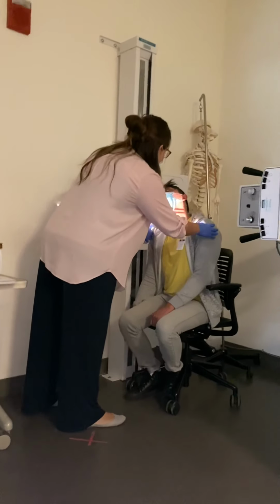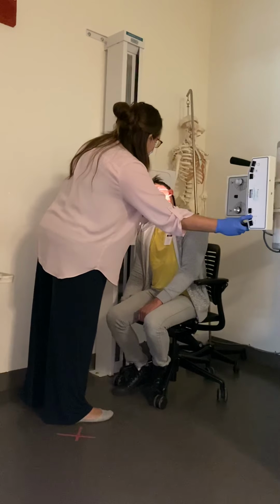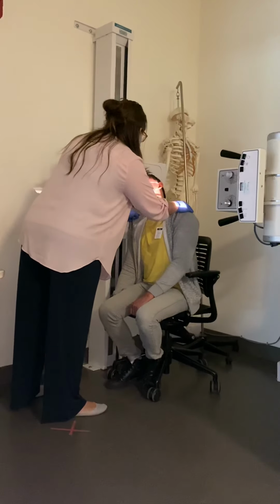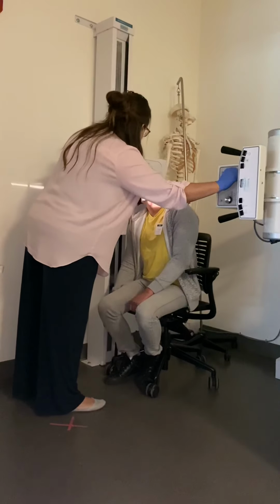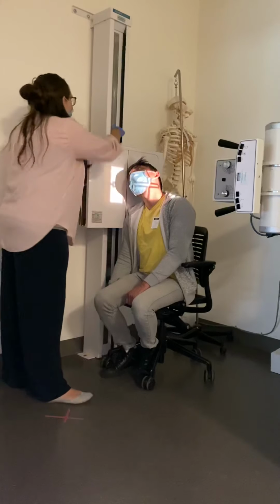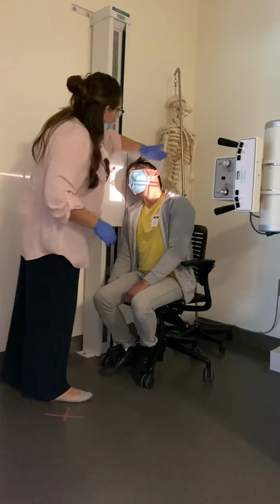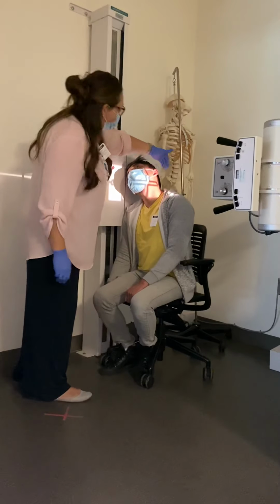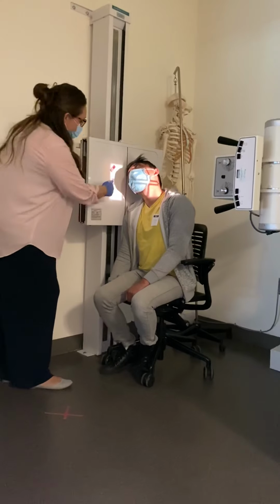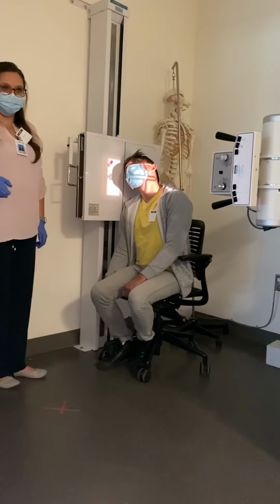So I'm going to have you stay just like that. I'm going to center just below the upside of the mandible, so my central ray is entering on that downside. I'll bring you forward a hair. I'm going to change my collimation to crosswise just to get all of the anatomy on there. I'm going to put my right marker here. We need to ensure that we have light above the EAM and behind the EAM to make sure that we're not clipping any of the mandible. And we should be able to see the shadow of the mandible here.